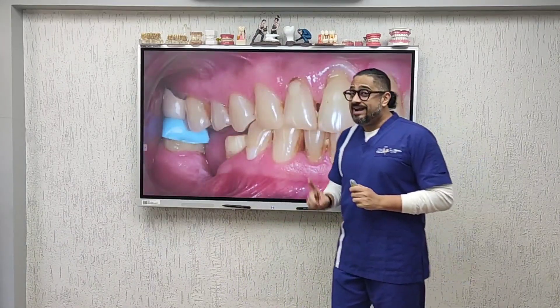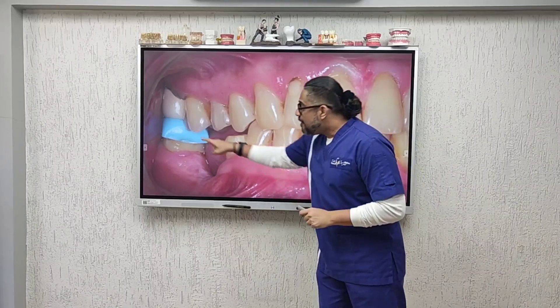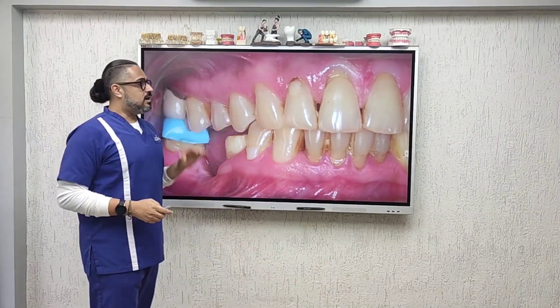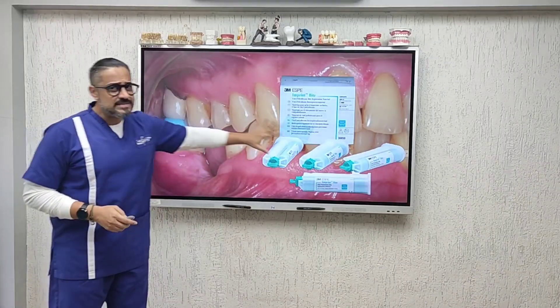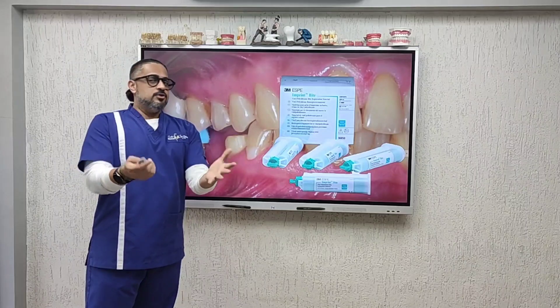You can get a little more flexible with this, provided you have a good laboratory that knows how to handle a bite. All you may need is a single tooth bite that covers the terminal molar — that will recreate the space the technician needs to provide stability on your cast.